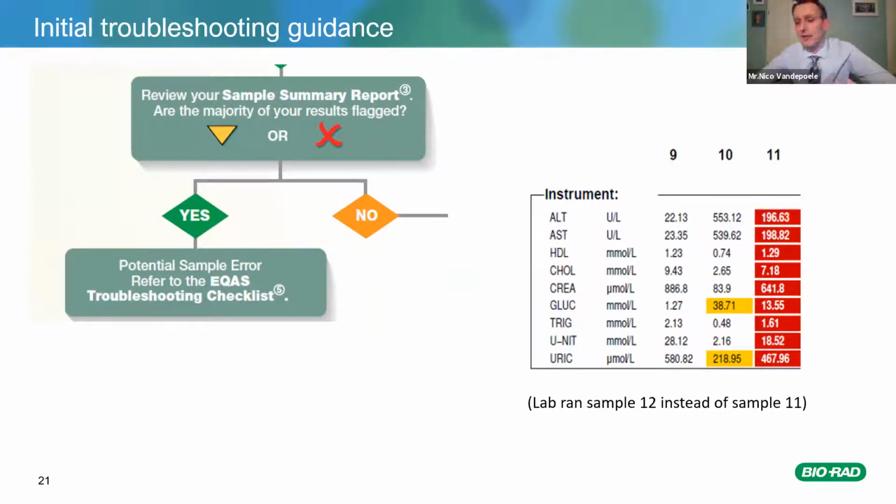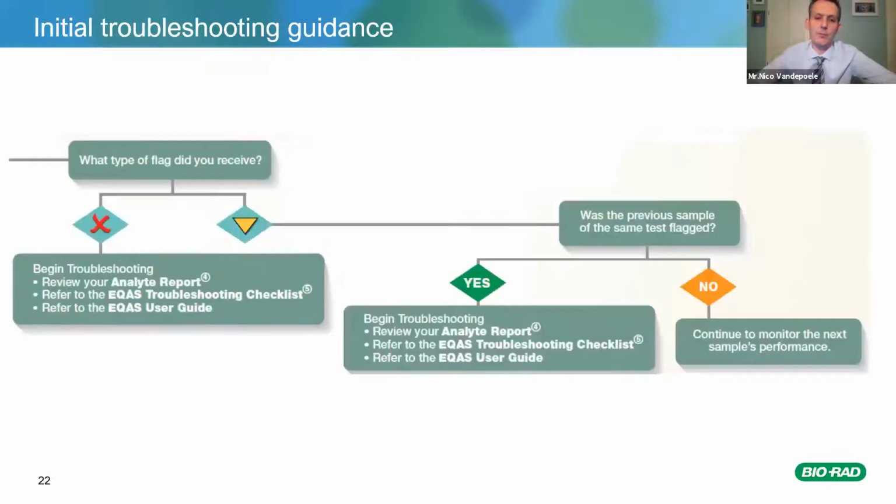People had a pipette that wasn't well calibrated or had an error, and so the liquid they added was way too much. So now all the results are low. So you would see all of your results affected. So these are all the steps you can take when you see these different events going on.